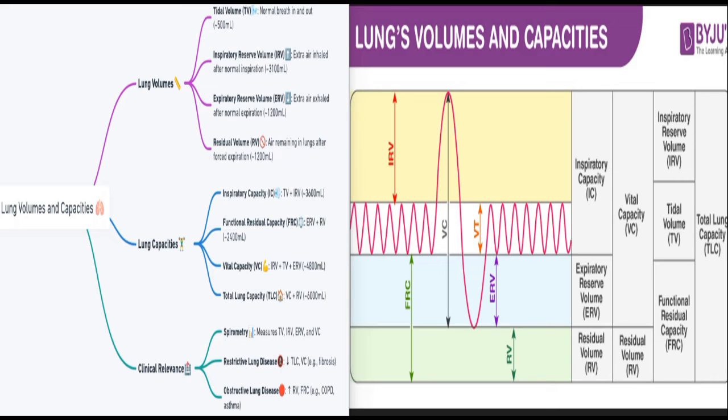Alright, so forced expiratory flow, FEF 25% to 75%, measures the airflow in the middle of a forced exhalation.